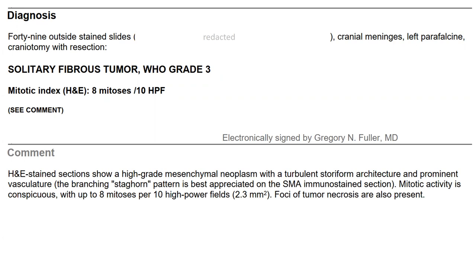The WHO 5th edition 2020 is encouraging everyone to define the high-power field. Right, exactly what it is. It's a simple calibration of your microscope. Most of them, it varies. That's why they're saying that, quote, high-power field. This is what it's going to be in most microscopes, very close to 2.2, 2.3, something like that.